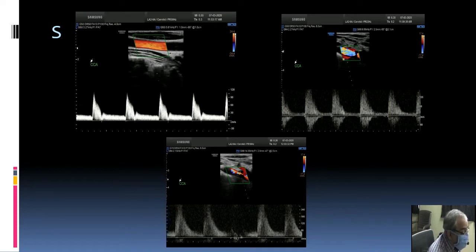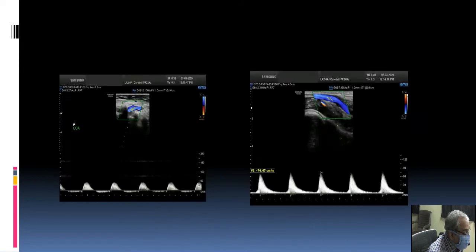This is just to show you an example of stenosis in the proximal subclavian artery. There is a high flow here. The common carotid artery is normal, and there is a stenosis. If you sample here, a lot of increased velocities are seen in that place. And the vertebral artery showed a partial steal, so that the diastolic reversal is there. We have seen that the vertebral always shows monophasic flow, always above the baseline or on one side of the baseline, even in systole and diastole. So this was just an example to show the vertebral steal.